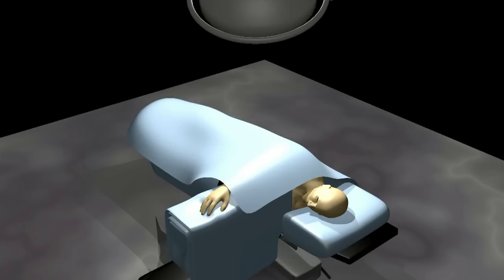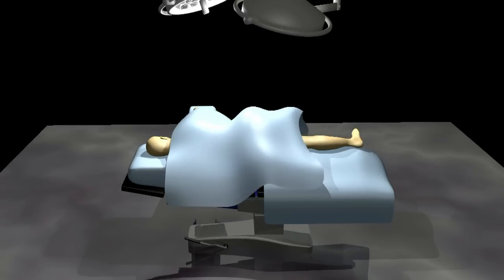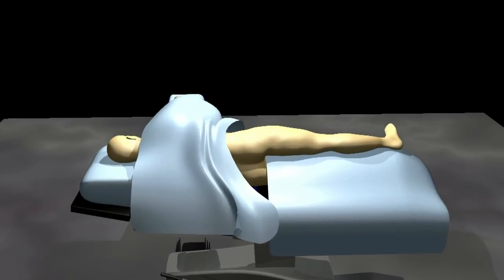Once the patient is asleep, the hip is thoroughly cleansed and sterilized. Sterile drapes are placed carefully around the hip to protect against contamination.